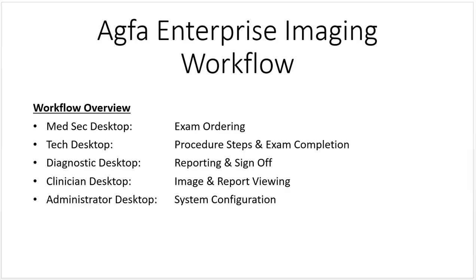Today's lesson about PACS is about our AGFA Enterprise Imaging workflow and the different desktops that are used. When you log in, you have a choice of several different desktops to choose from, and each desktop is really specific to a role within the organization, within the radiology department.